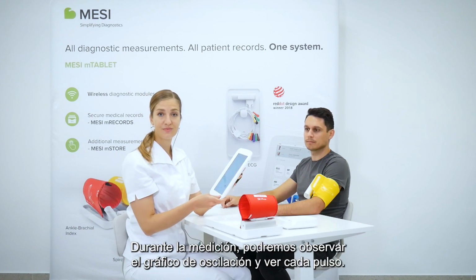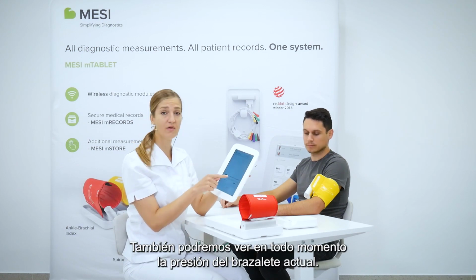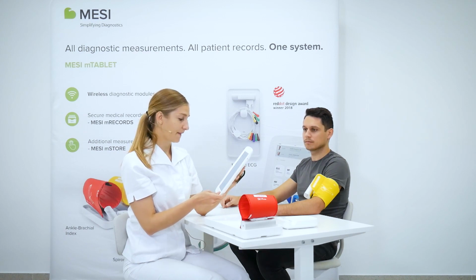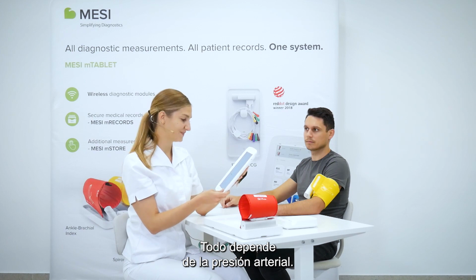During the measurement, we can observe the oscillation graph, so we can see each individual pulse. We are also always able to see the current cuff pressure. The measurement takes about a minute or so. It all depends on the patient's blood pressure.